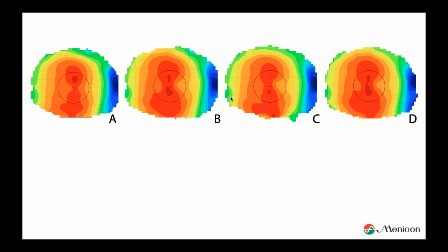Why? Well, what we see here are several topo maps. We see A, B, C, and D, the one from the question. And we see that several images are not looking the same. B and D look the same, but what we suggest to do with topography is doing more topography measurements at once. So only doing one measurement and relying on that is not useful. Keep using your Javal keratometry, but don't use topography then. Topography is only reliable if you do more measurements and compare them first.